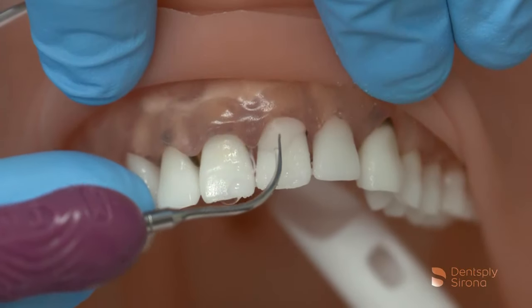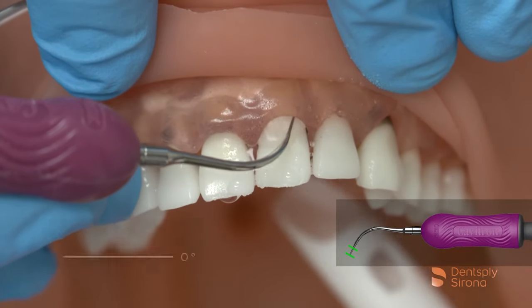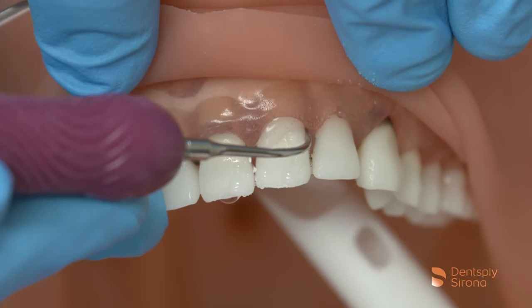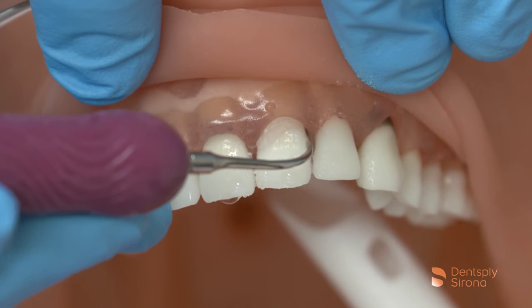The clinician will begin on the clinical crown, mindfully adapting 2-3 mm and angulating the insert no more than 15 degrees to the long axis of the tooth. The strokes are small, 1-2 mm overlapping, to ensure thorough debridement of the biofilm and any light deposits.